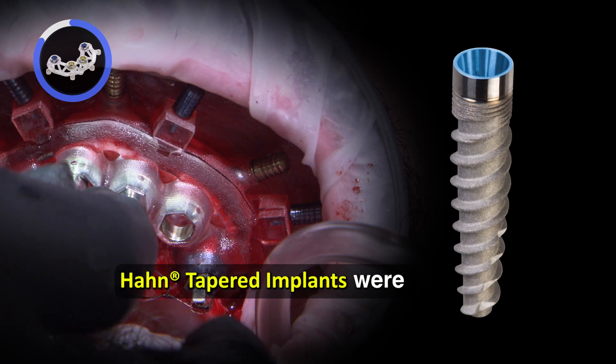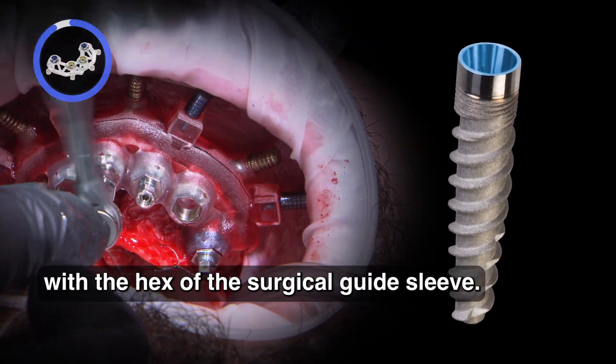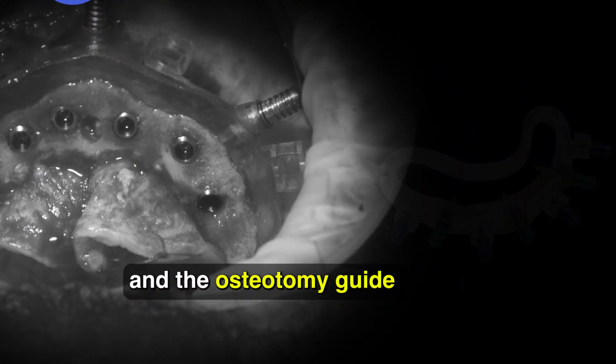Han tapered implants were placed with ease, being sure to align the hex of the implant mount with the hex of the surgical guide sleeve. After the implants were placed, the interlocking pins and the osteotomy guide were then removed.